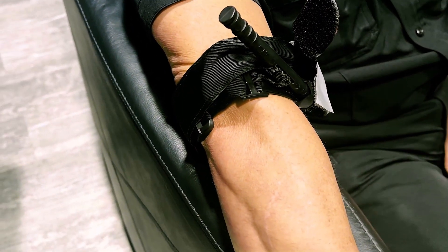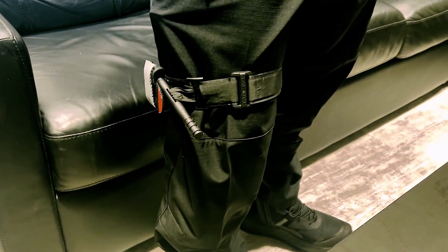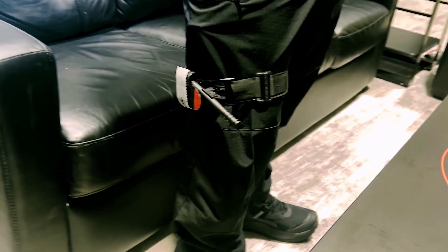When applying a CAT, remember not to place it directly over a major joint such as the knee or elbow. Also, do not place it over heavy clothing or full pockets, as it may not compress properly.